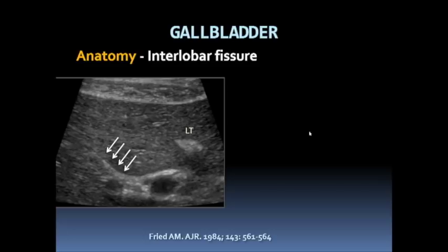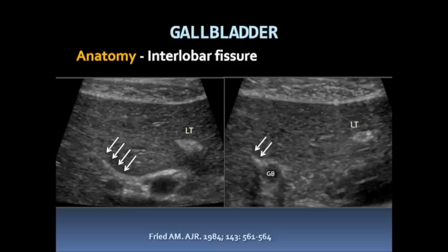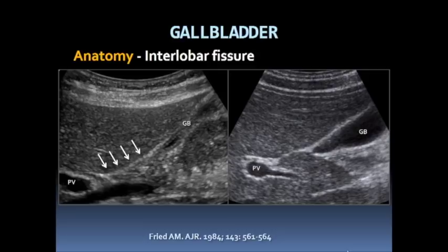When the ligamentum teres is identified, you can look for a linear echogenic line just to the left of it, which delineates the interlobar fissure. Once this is identified, if you scan slightly inferior to this line, it should lead you right into the gallbladder, as demonstrated in this patient with a decompressed gallbladder, interlobar fissure, and ligamentum teres.